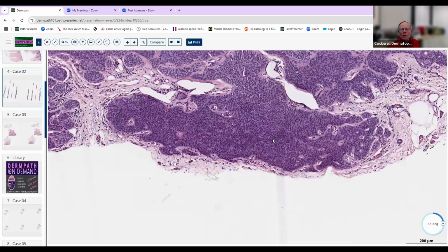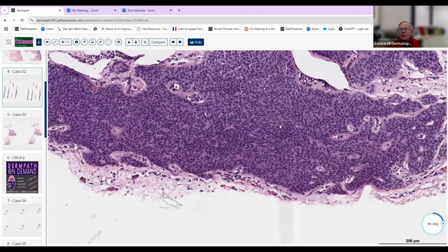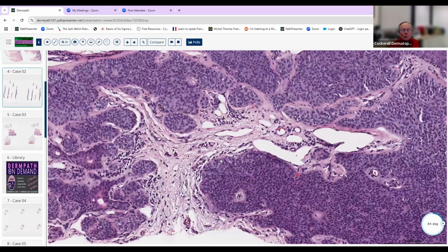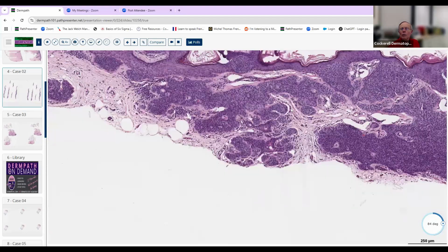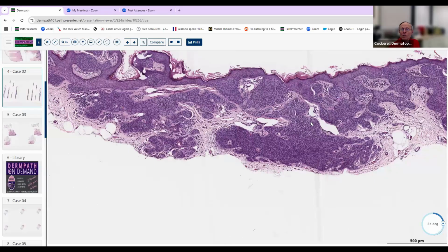And so we start thinking basophilic, is it something like germinative epithelium, possibly something that theoretically could be sebaceous? Could it be eccrine or apocrine, or could it be follicular? And if you start seeing things that look like papillary mesenchymal bodies, or you see clefts between the epithelium and the stroma, like right there, you start thinking about more likely follicular epithelium and primitive follicular epithelium. And so when you think about the hair follicle, we generally tend to think of three parts: the infundibulum, the isthmus, and the inferior portion of the follicle. At the isthmus lives that little mantle zone.